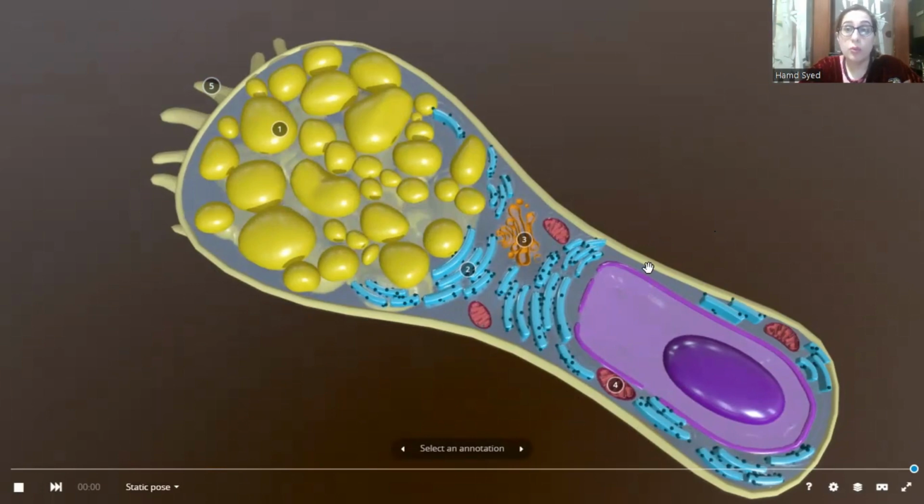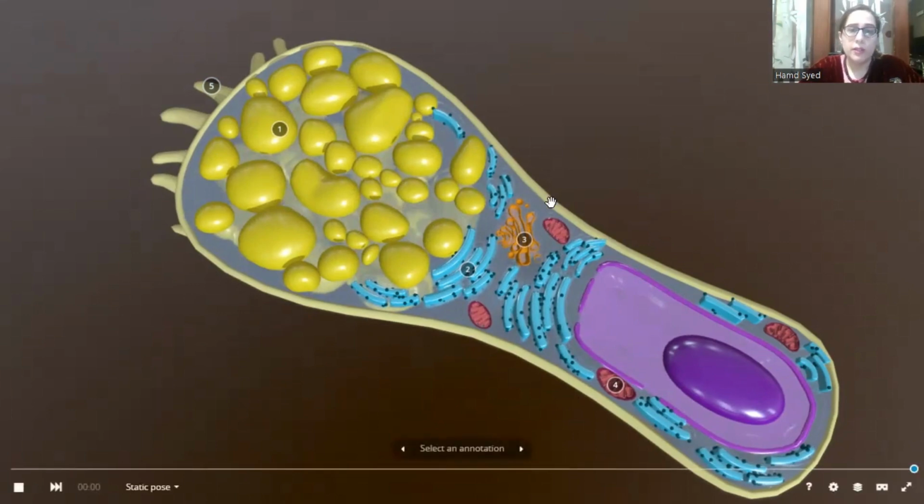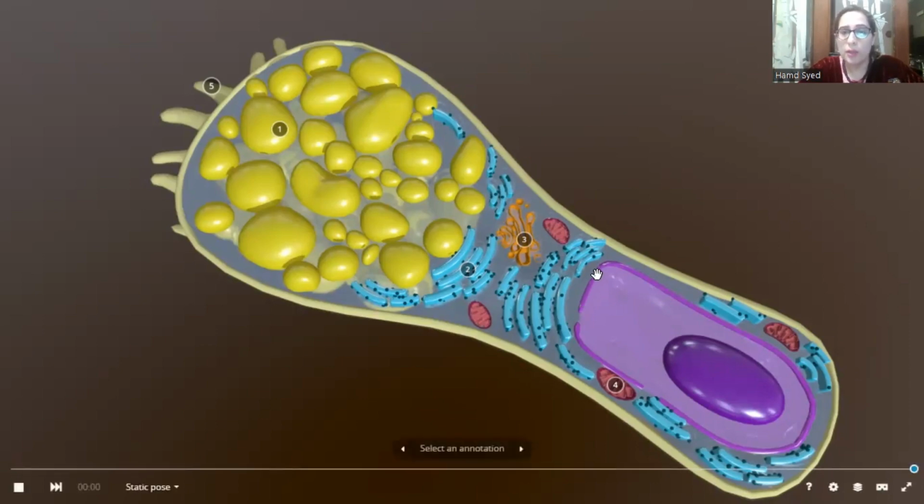And this is why we use the word goblet, because it is in the shape of a large round drinking glass, which has a narrow stem or base. So let's first look at this basal region. The basal region, I told you, has the nucleus, and this appears basophilic in the stained tissue slides because of the large quantity of rough endoplasmic reticulum. This is responsible for the synthesis of the glycoproteins. And also you can see the mitochondria, which are present over here.